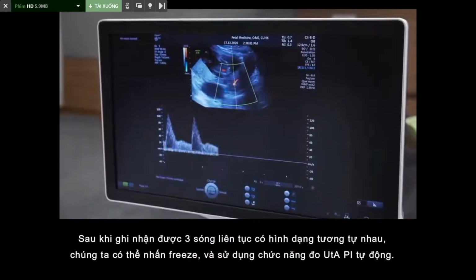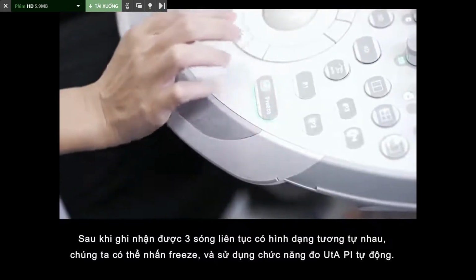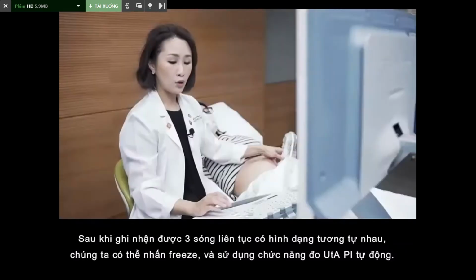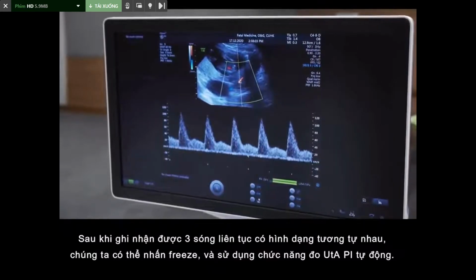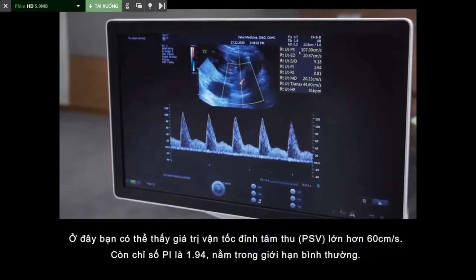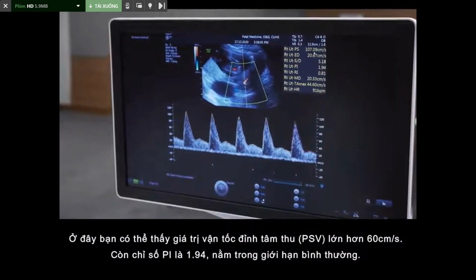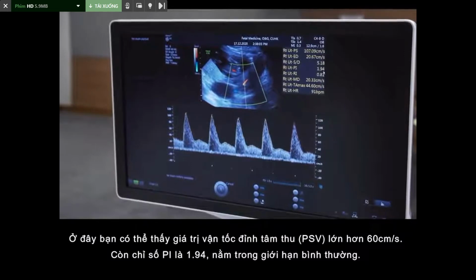Once you see 3 consecutive waveforms that are similar, then you can freeze the image. Then you can use the automatic function to measure the uterine artery pulsatility index. And here you can see the values of peak systolic velocity being greater than 60 centimeters per second. And then you can see the pulsatility index of 1.94, which is within normal range.